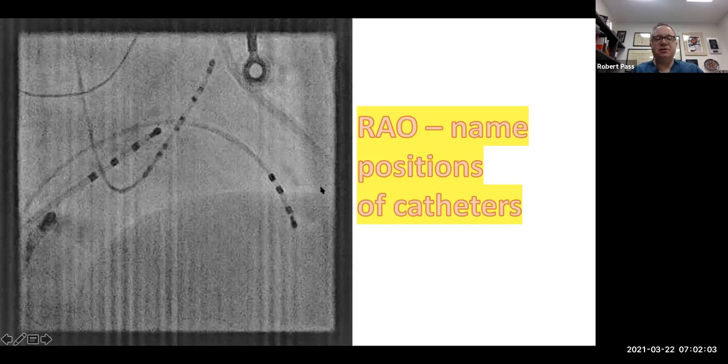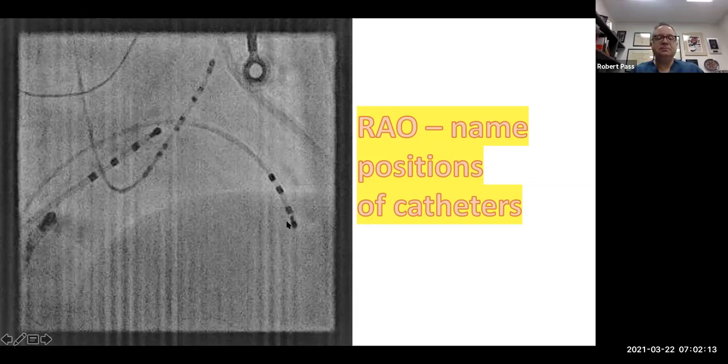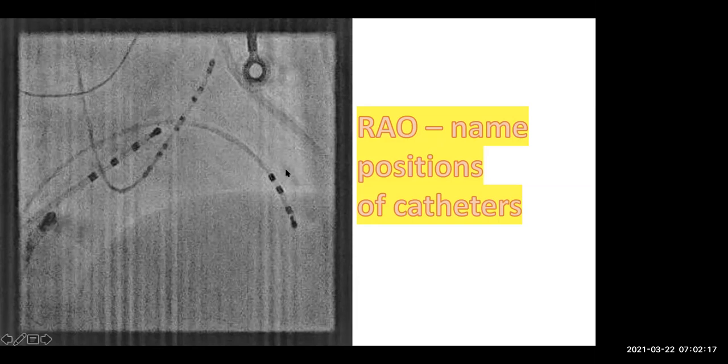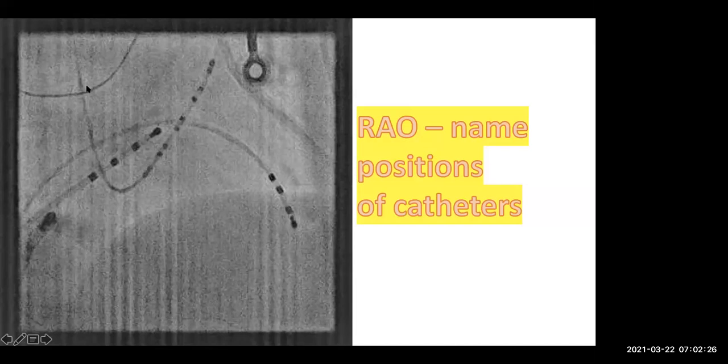Where's this going? So that looks like maybe the His catheter. This is the His catheter, you think? I think that is not correct. Where is this? All right, well, let's start with this then. Where is this catheter? So that looks like the CS catheter.